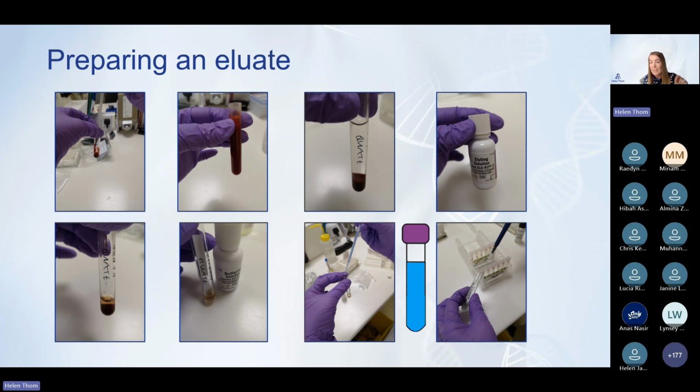You keep a little bit of the supernatant because you want to test it to make sure that you have washed the cells properly. But now you get this acidic solution, which is just the kit we used in the lab when I was there, and you add it drop by drop. So if you had 10 drops of patient's red cells, you'd add 10 drops of the acidic solution. Then you centrifuge it. This time you want to keep that supernatant.